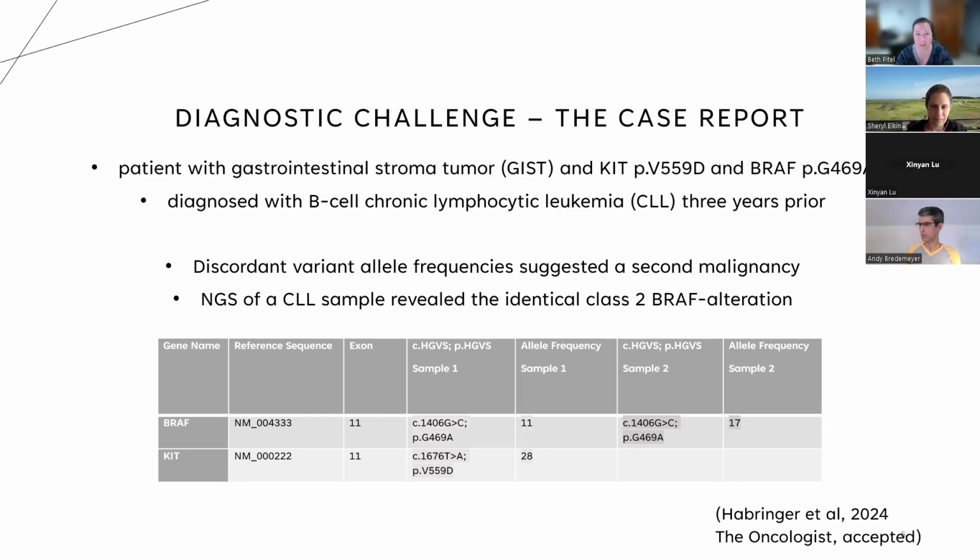Another thing that comes into play when we're dealing with multiple tumors sometimes is quality metrics of the assay. From the analytical chemistry part of the assay, sometimes the algorithms have a hard time understanding when a patient has two different tumor populations, and so it could trigger contamination or noise metrics more.